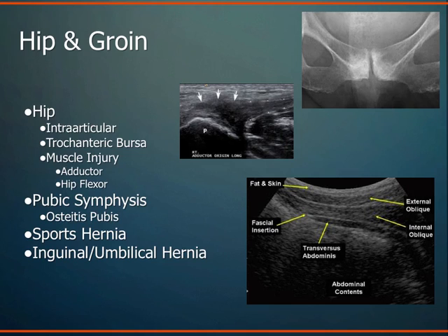Very easy injection to do under ultrasound guidance. You see exactly where you're going, very superficial structures, as well as muscle injury. So here's adductor muscle tear and associated adductor tendon. So you see this collection of hematoma, tissue disruption, and retraction of tissue in the area of tear.